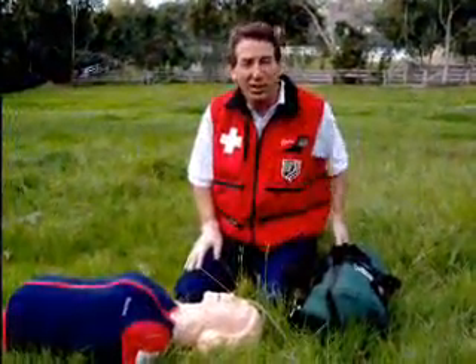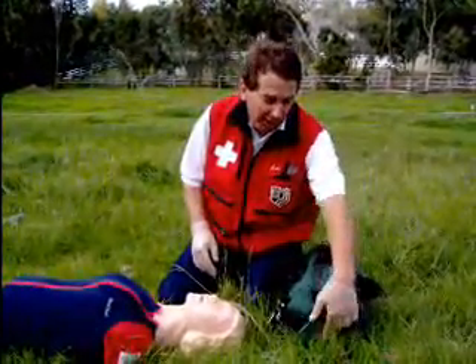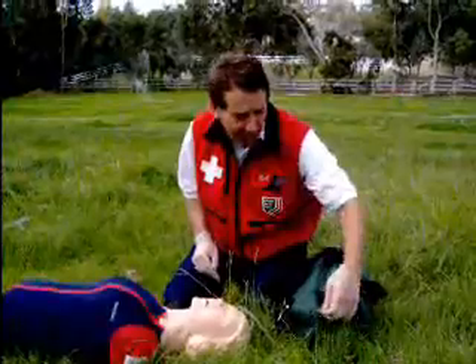Hello, I'm Robert and this video is going to be about oxygen. I'm going to show you how to put oxygen on and how to handle the bottle.